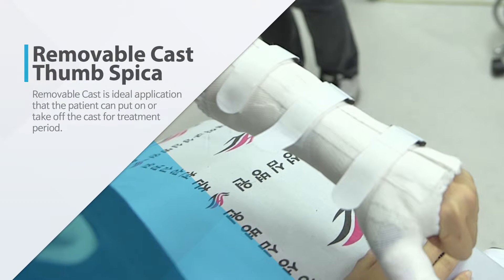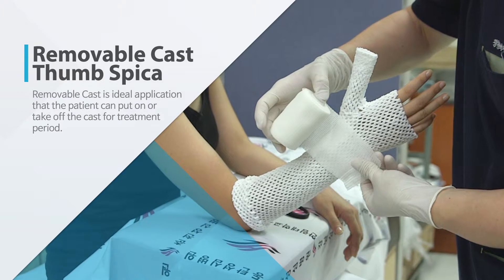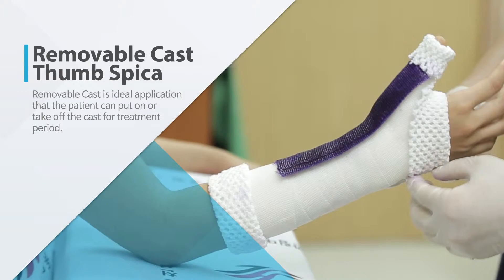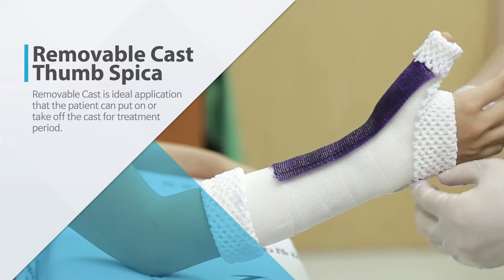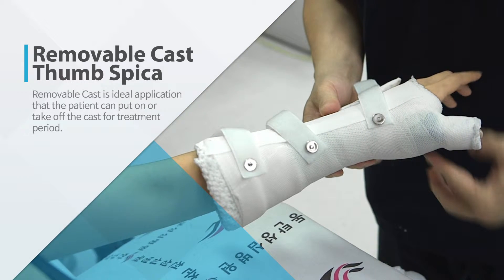A removable cast is an ideal application that the patient can put on or take off during the treatment period. It helps patients with ideal healing and rehabilitation by providing mobility and also immobilization at the same time on the injured part, depending on each application.